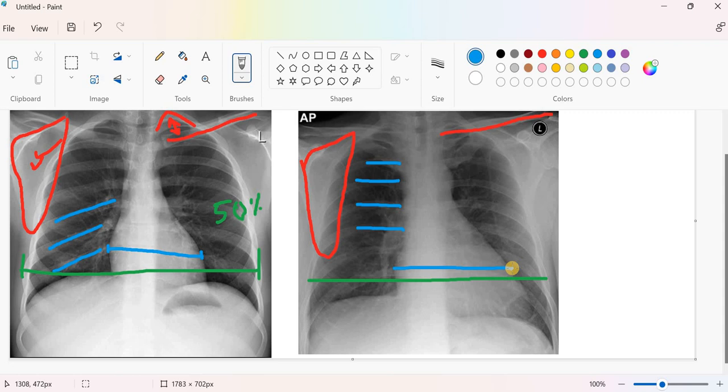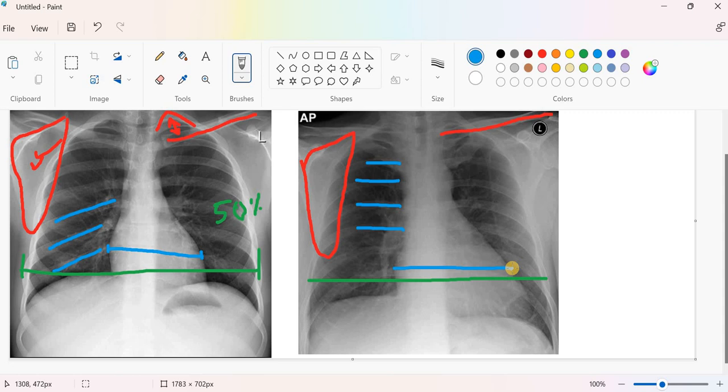So now, three points regarding the bones. Look to the clavicle and how far it is from the apex of the lung. Look at the scapula if it is covering or hiding or encroaching on the lung field, yes or no.